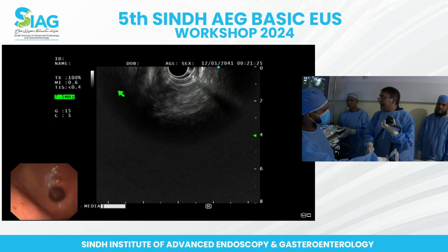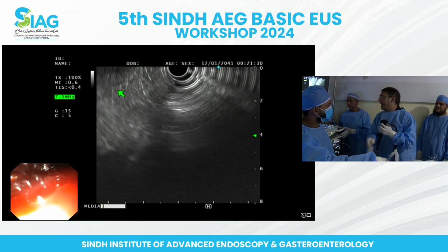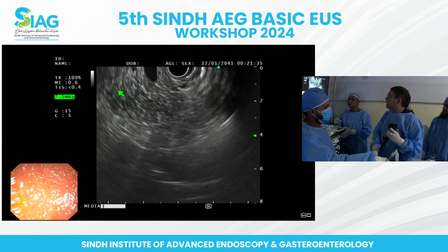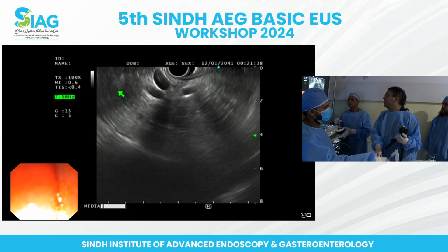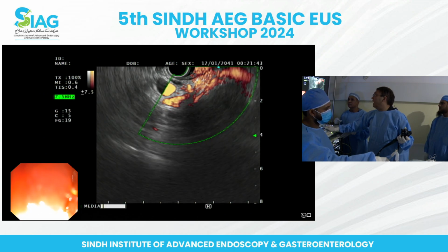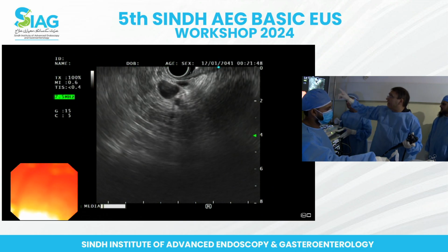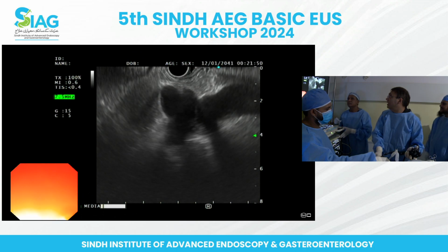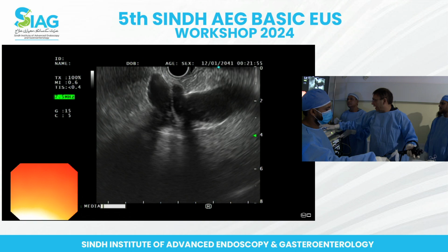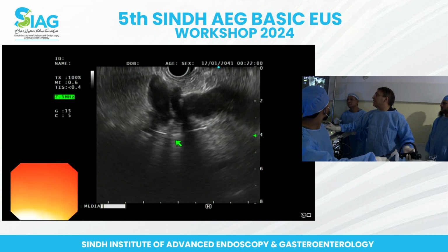From the duodenum, the right lobe of the liver is much easier to find, along with those segments, and I'll show you in just a second. The only thing you really need to find is your portal vein. If I put a Doppler here, you see the portal vein right there. Now you need to follow that portal vein towards the liver. I'm right at the liver hilum right now, okay? This is a portal vein right here, a branch going downwards. That's the left portal vein.